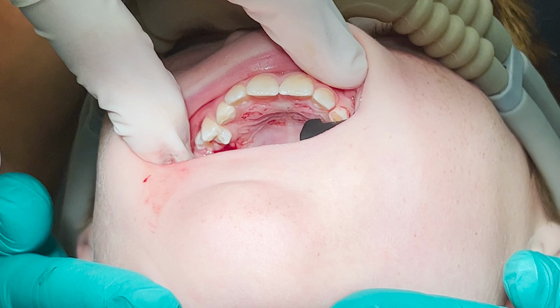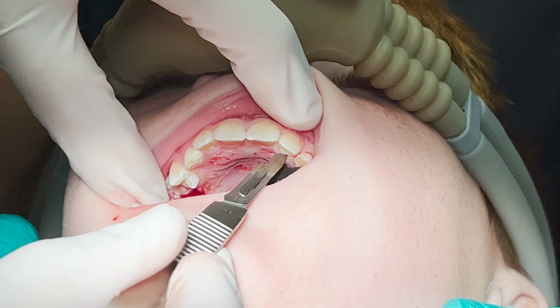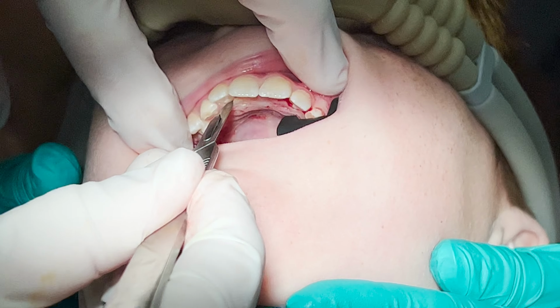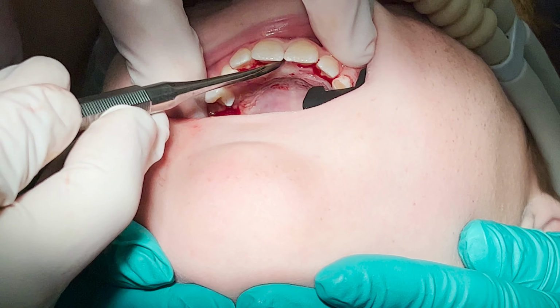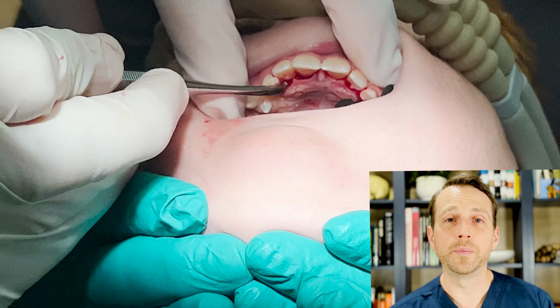Mesiodens removal is a great in-office procedure. I started this patient on nitrous oxide, and after local anesthesia, I'm going to gently elevate a palatal flap. Here's my incision, which is an intersulcular incision. And then I'm going to take my periosteal elevator and start to retract the tissue. I want to be in a subperiosteal plane to minimize damage to the palatal mucosa.